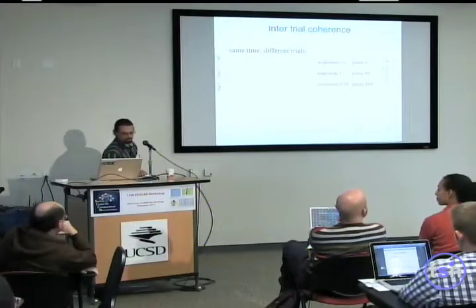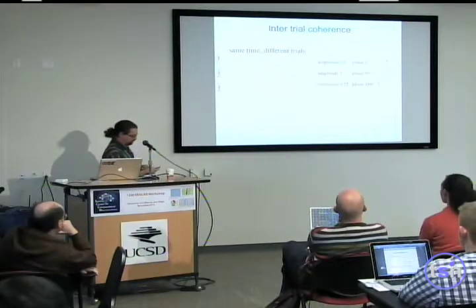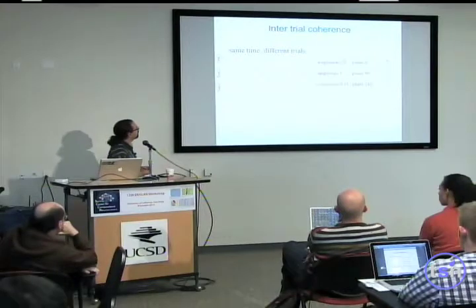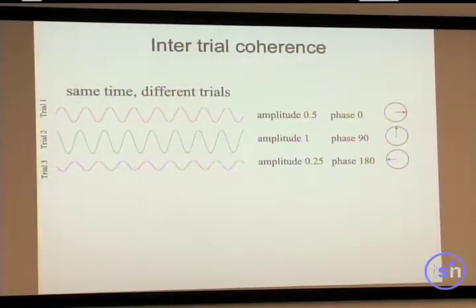So now we're moving to intertrial coherence. Scott talked a little bit about that, and here we're going to see what this corresponds to. We had these vectors, and we've been ignoring the orientation of the vector. We just looked at the length, took the square, said this is power, and this is all that we were interested in so far. Now there's also some information in the phase.